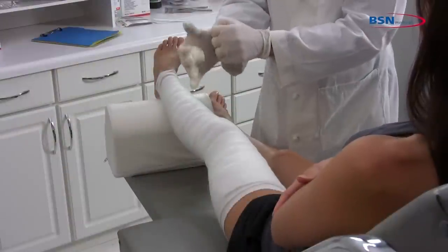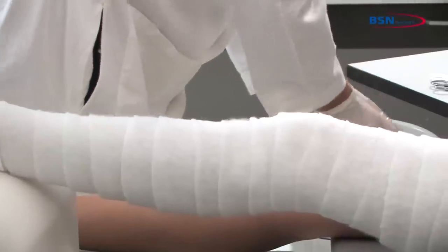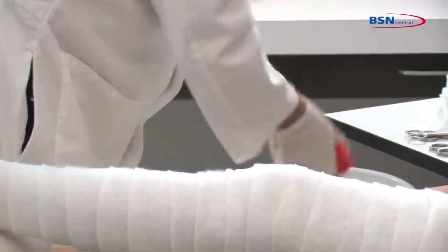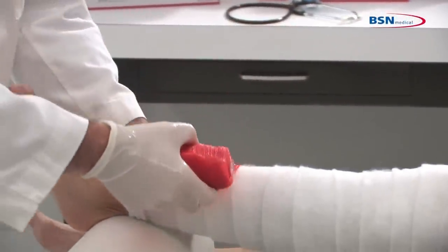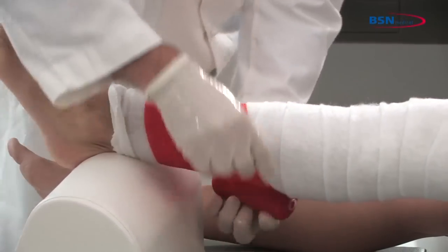Begin by putting on protective gloves before applying the cast tape. Dip 3-inch, 4-inch, or 5-inch cast tape in water, squeezing one to three times. Remove from water and squeeze one time to remove excess water.